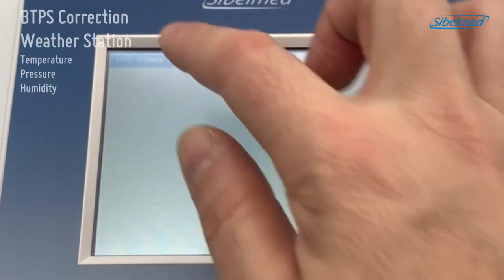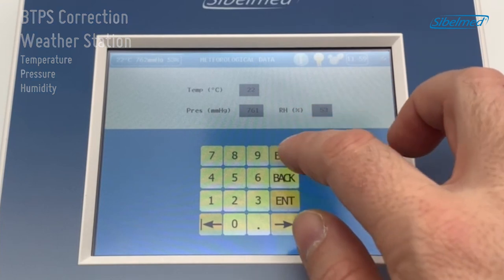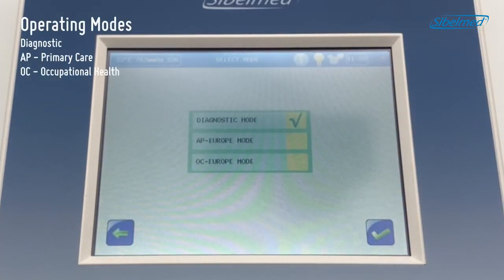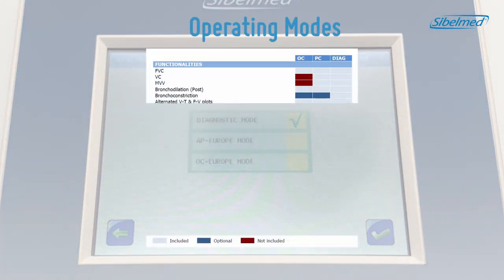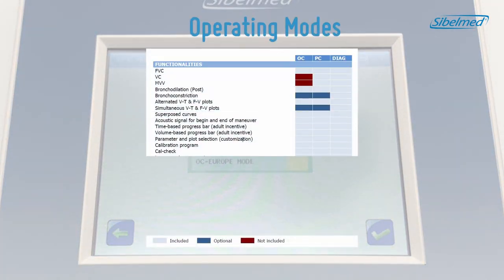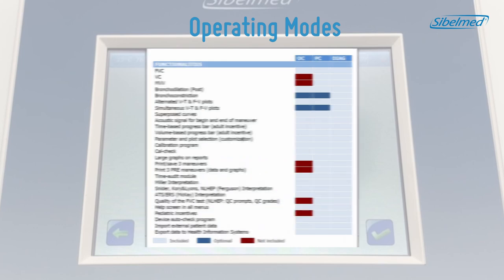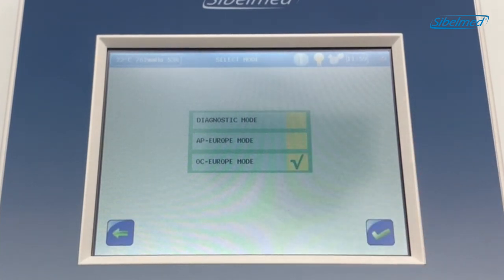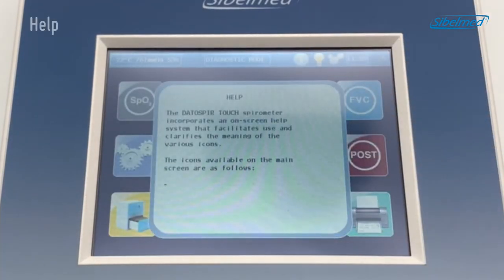At the top we have a toolbar that shows the atmospheric data values. In the top central part we can choose the operating mode, so the functionality is modified to fit our needs. Each mode includes an adapted profile with some options and features activated. We currently have the diagnostic mode enabled, which is mainly used in hospitals, but there is also AP for primary care and OC for occupational health.